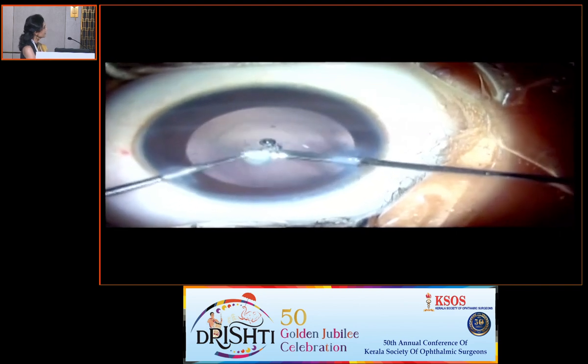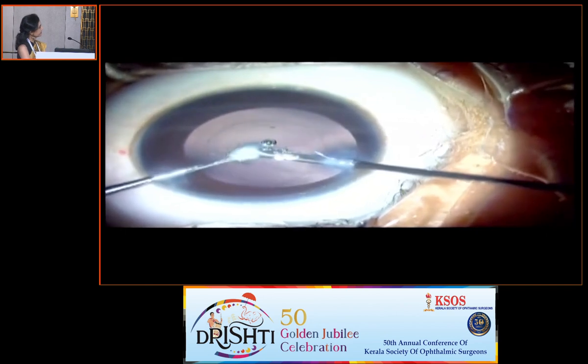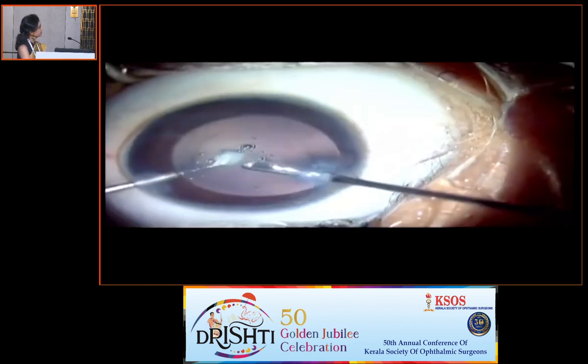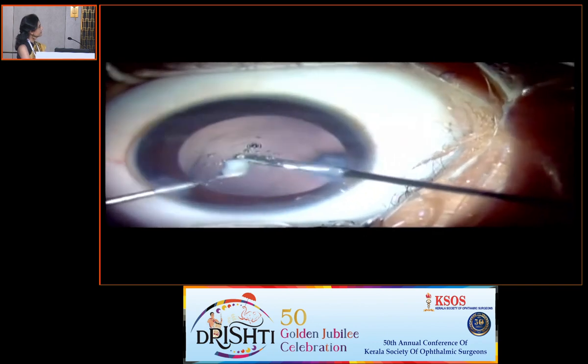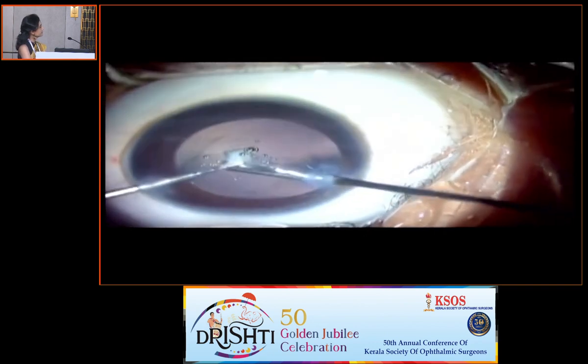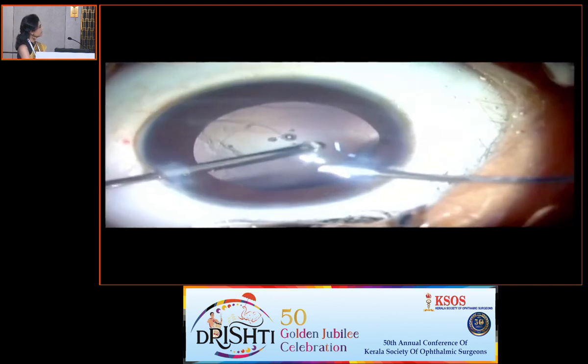nerve head to the posterior capsular plaque, and we are cauterizing the stalk with an endocautery so that it should not bleed and produce a vitreous hemorrhage, and we need to call our vitreoretinal surgeon for help. So the cauterization is marked by the appearance of the air bubble, you can see here, and the plaque is eaten away with the cutter.